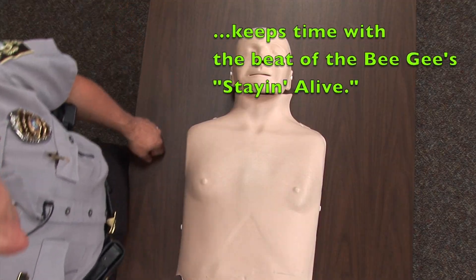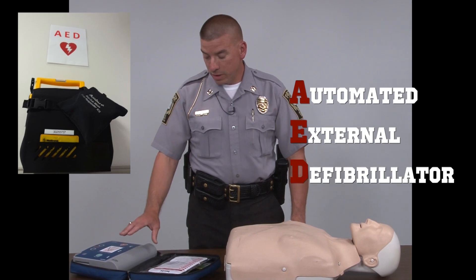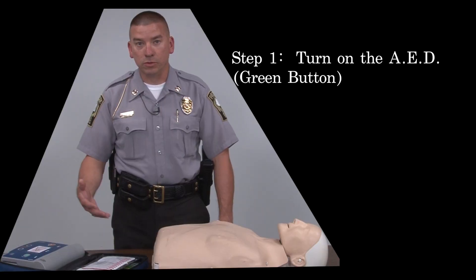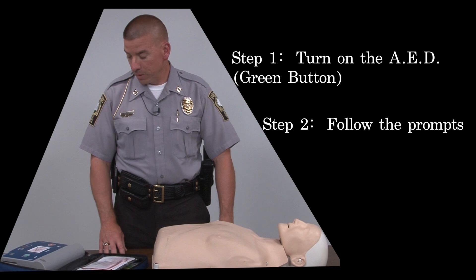If you have an AED — Automatic External Defibrillator — present, this is vital for saving a life and restarting a heart. The most important thing you need to do is to turn it on. From that point, follow the prompts and it will tell you everything to do.